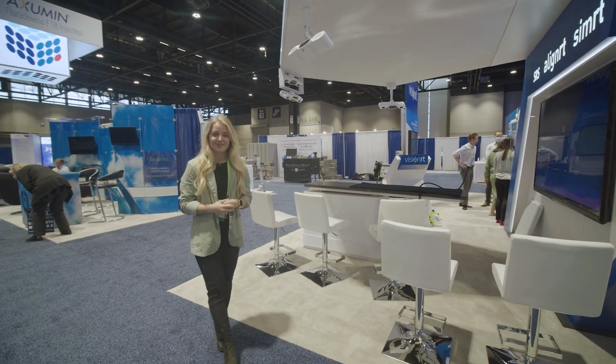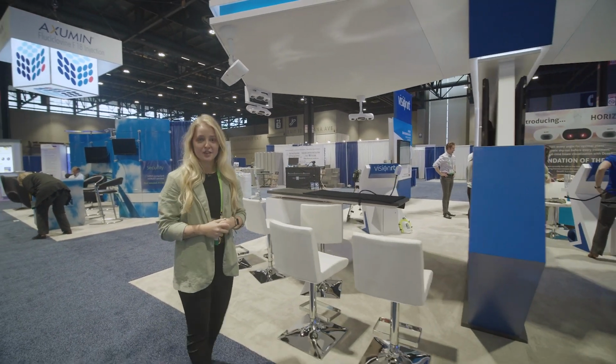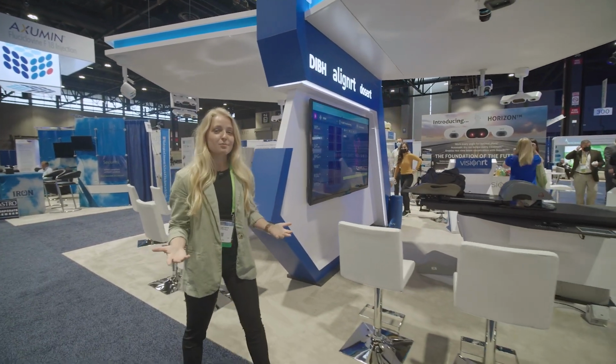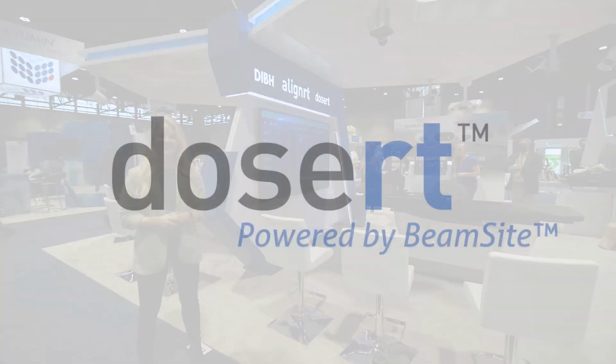With the treatment planning process complete, let's head on over to Meredith, where she can show us a DIBH workflow using Align-RT, as well as debut our newest product, DoseRT.